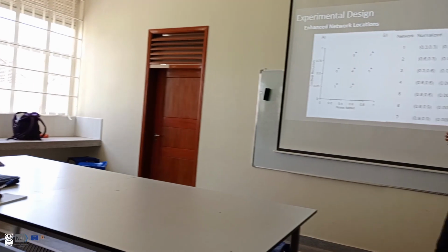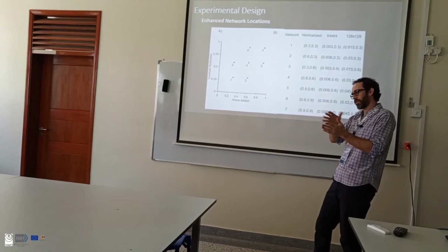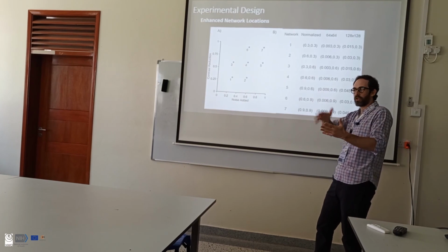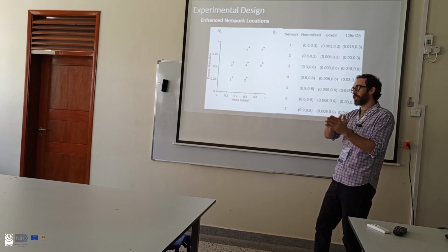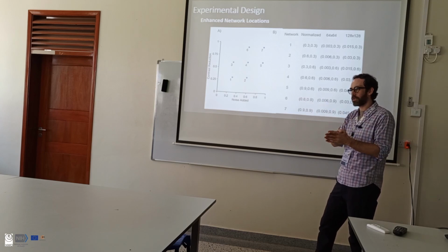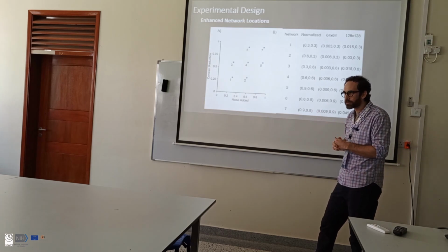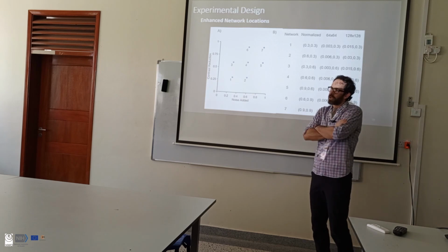In fact, we might have better contrast in some cases than in high field, because contrast doesn't really work that way. But I wanted to look at the spectrum and see what comes out, rather than simulate what low-field MRI would actually do, since I don't even have low-field MRI. So, can you draw a relationship between contrast reduction and noise addition? Is it direct proportionality? Not necessarily.